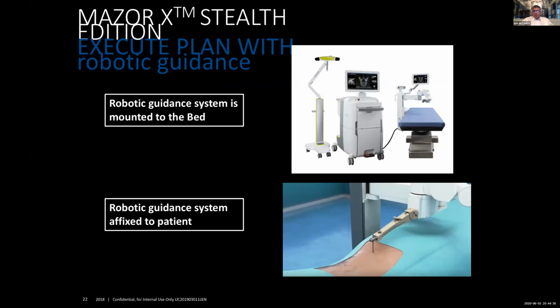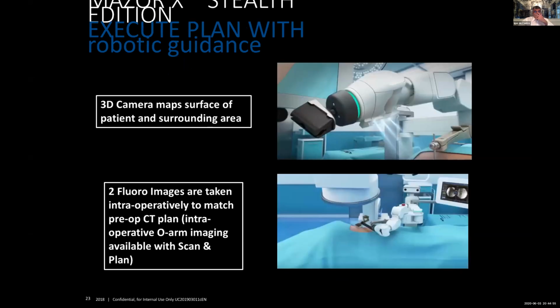So the pin attached to the superior iliac crest was already explored by Professor Isaac. If you do a long construction, that will be away from your point of fixation, so we have to do another technique, which is to put bars and put pins on the spinous process. All that needs to be added if you do a very, very long construction. And the robot arm on that picture on the superior part there, you can see a very steady arm.